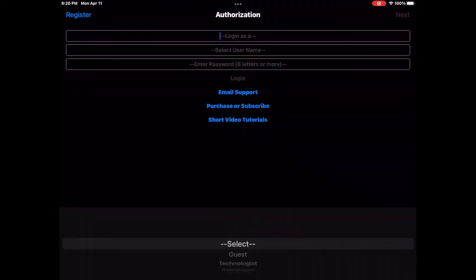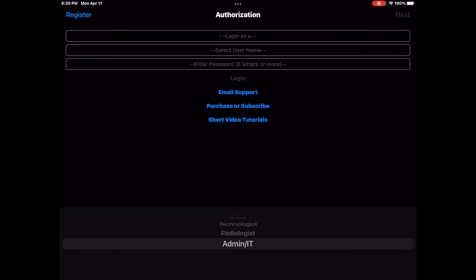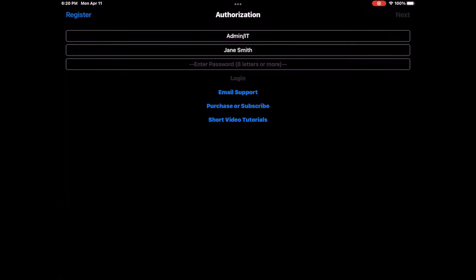You need to log in as Admin IT. If you have not created an admin account yet, watch the tutorial on how to register a new Admin IT user.